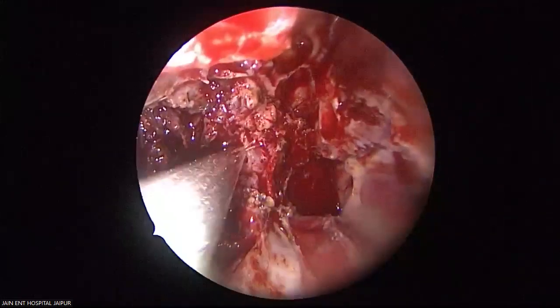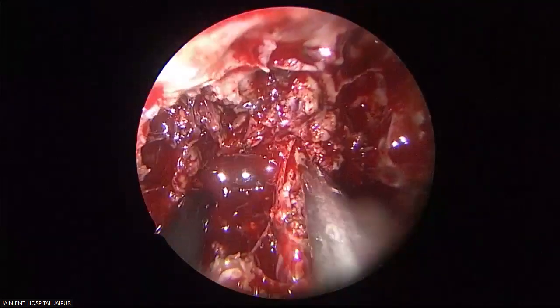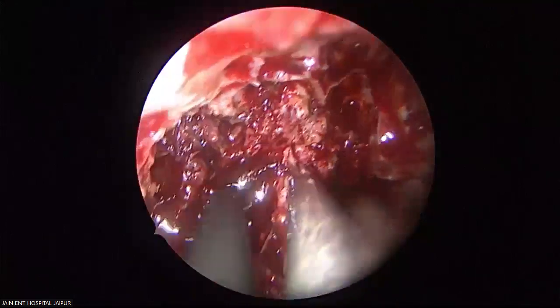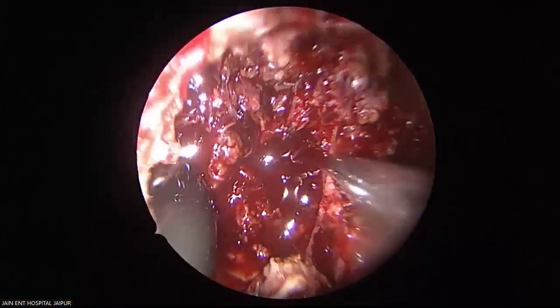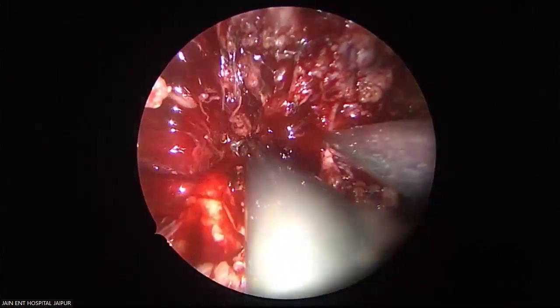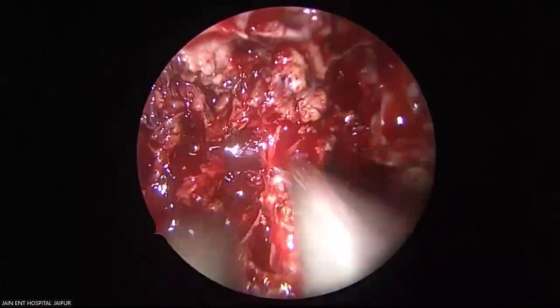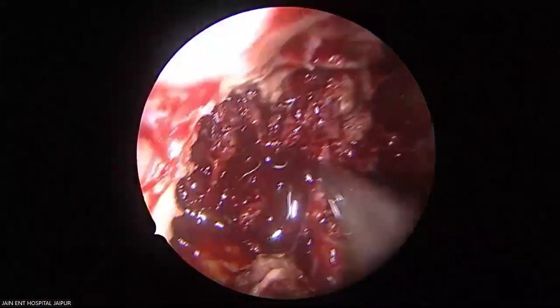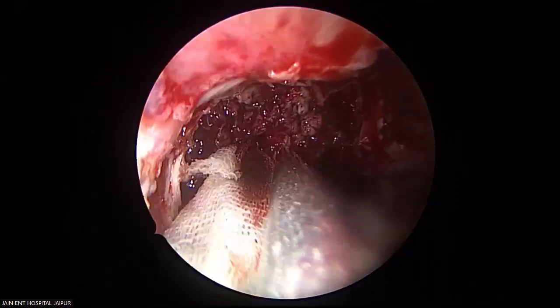Dr. Guru Swami from Mysore is asking a question. See, this is the pterygoid component here. This is the tumor. This is the infratemporal fossa, which is empty now. This is your temporalis muscle. You can see laterally. This tumor we have removed from 2 centimeters below, pulled out everything. Little bit of the pterygoid venous oozing.